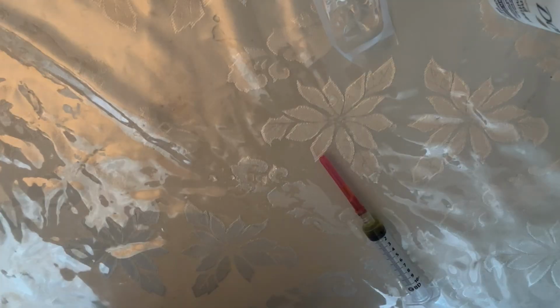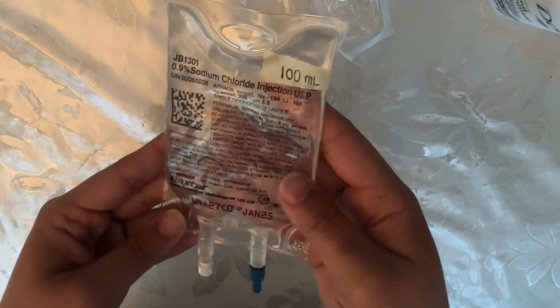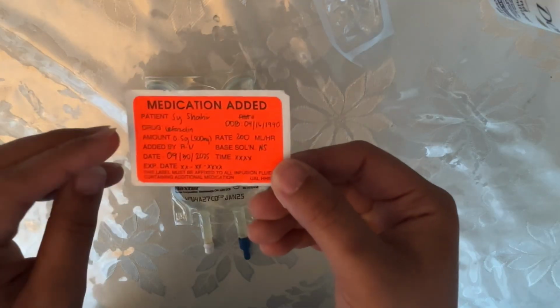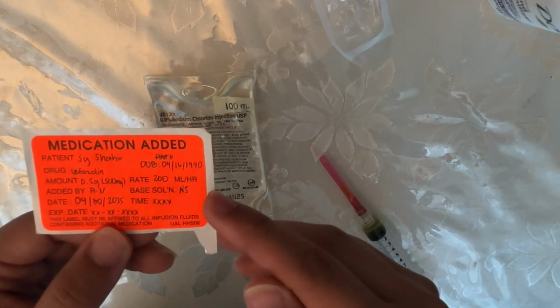So per medication instruction, we need to dilute it in 100 ml normal saline. So we just need to make sure that our saline is intact and not cloudy or anything abnormal, and it's not expired. So make sure it's normal saline. Now we need to prepare the medication label before we inject the medication into the normal saline. I am writing my patient name, the drug, the amount, the signature, the date, the expiry date of the medication, the time of administration, and then the rate.